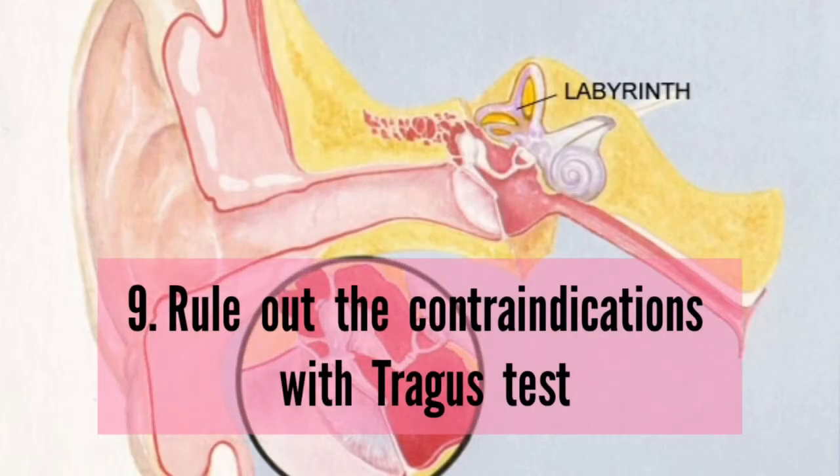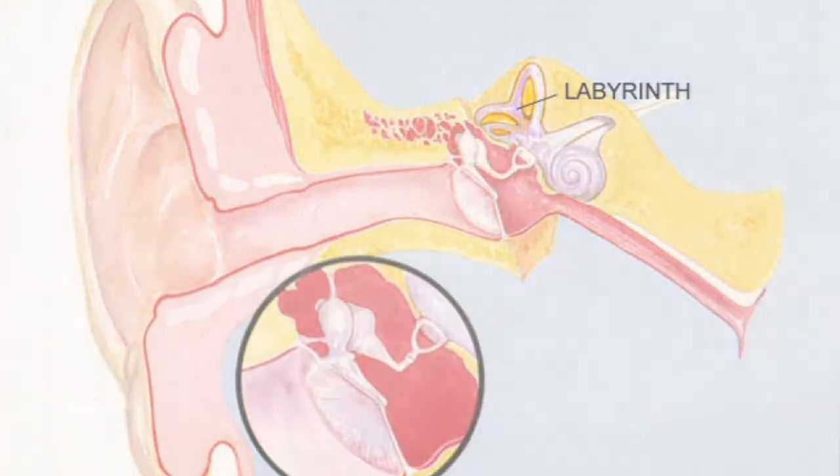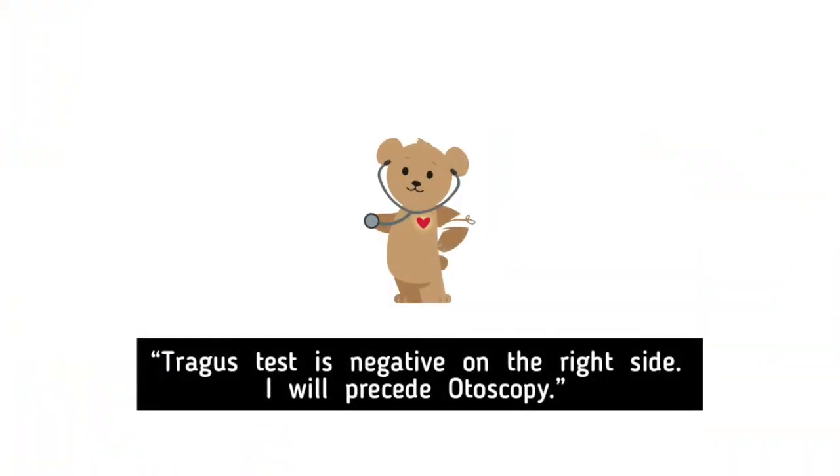Rule out the contraindications with the tragus test. Tragus test is negative on the right side. I will proceed with otoscopy.